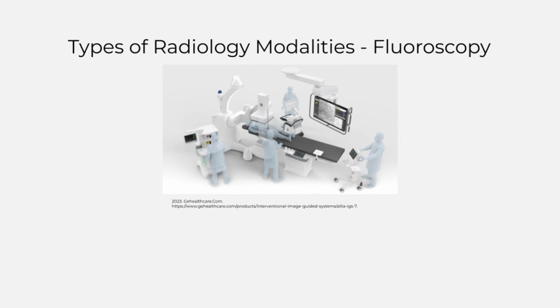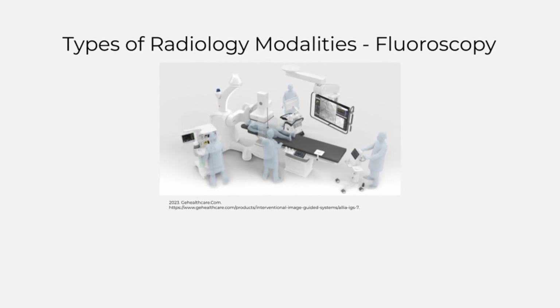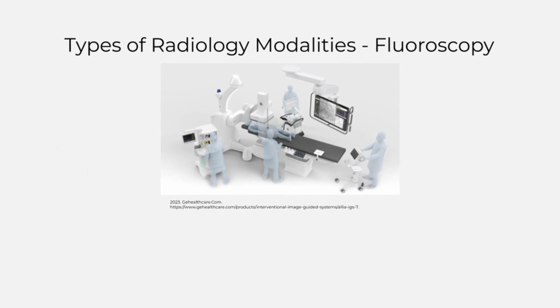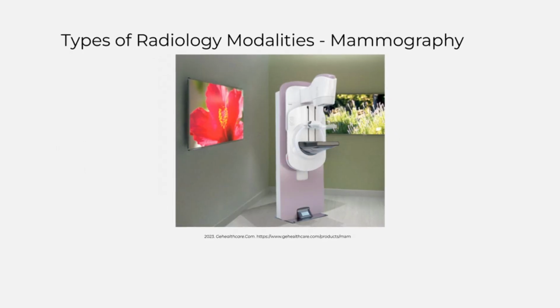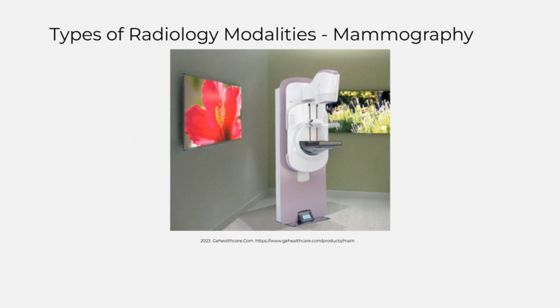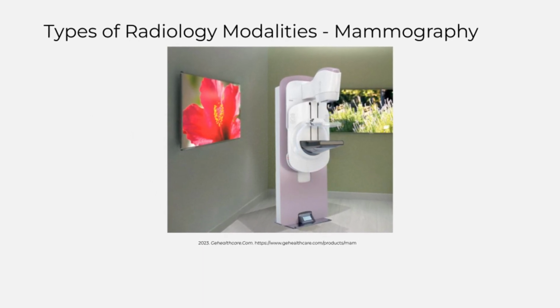Fluoroscopy, a real-time imaging method often used during surgeries or procedures. A portable version called a C-arm is used in operating rooms. Mammography is a specialized X-ray used for breast exams. There are two types, one for screening and one for diagnosing problems.